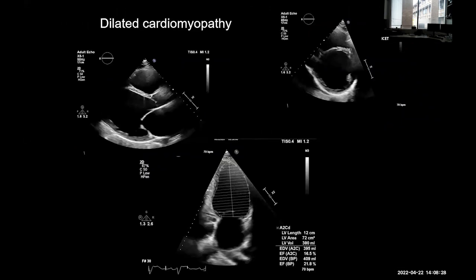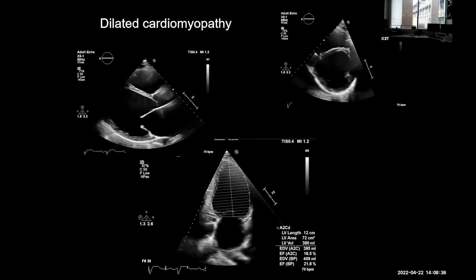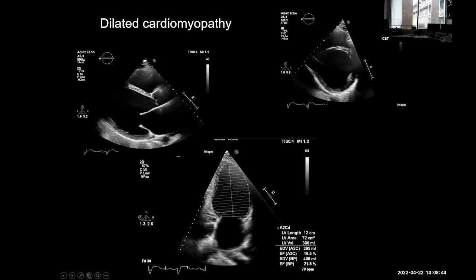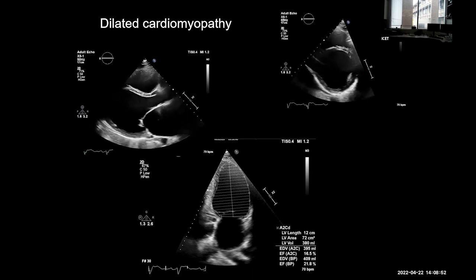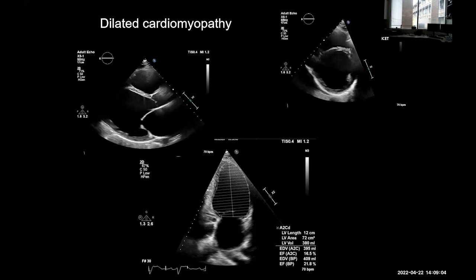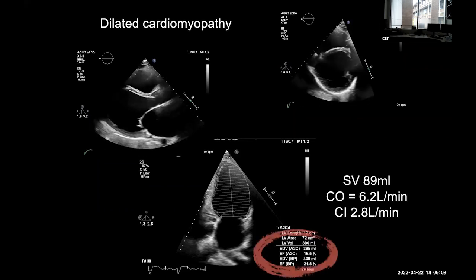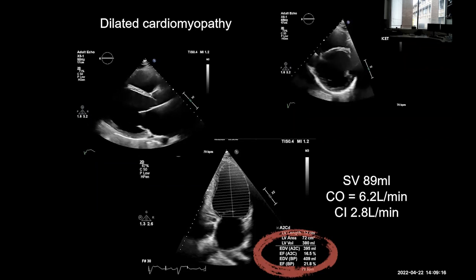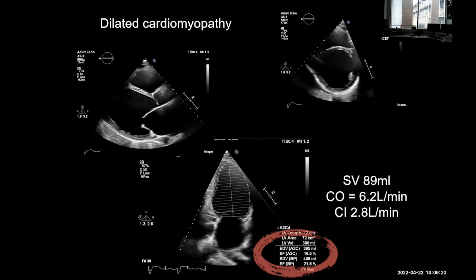It's important when interpreting ejection fraction to consider LV geometry. This patient has a burnt-out dilated cardiomyopathy with a terrible ejection fraction of 21%. The learning point is that because of LV remodelling with large end-diastolic volumes, stroke volume can still be preserved even though ejection fraction is down. This patient has a stroke volume approaching 90 mils and a cardiac index of 2.8, so he's warm, well-perfused and not shocked despite appearances.